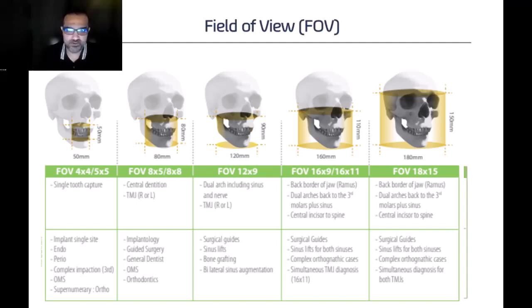And this is great for clinical implications, which include especially orthognathic surgery. If you have surgical guides that you need to use for multiple significant implant therapy for full mouth reconstructions, typically orthodontists and oral surgeons will use these larger fields of view in complex cases, which there needs to be some kind of reconstruction specifically.